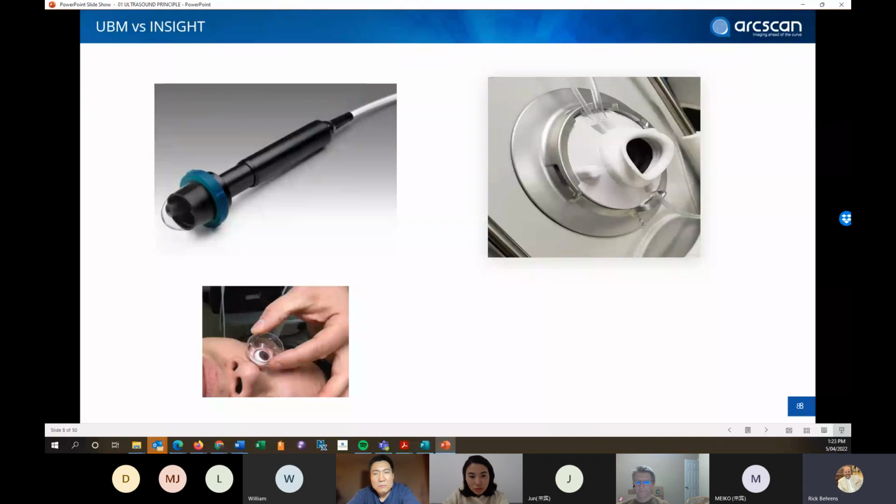So instead of the patient being laid down and the saline coming to the patient, we're going to lay down the patient facing down, and leaning down, and all this area, which is the eye seal, is filled with BSS and has a membrane that protects from the probe.